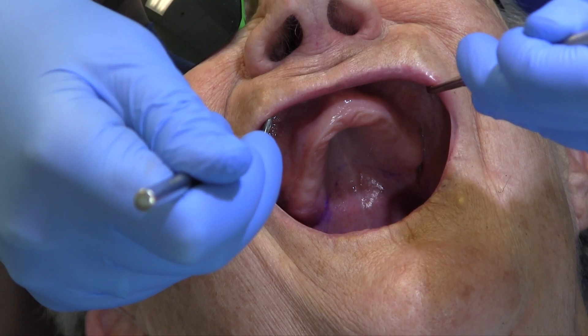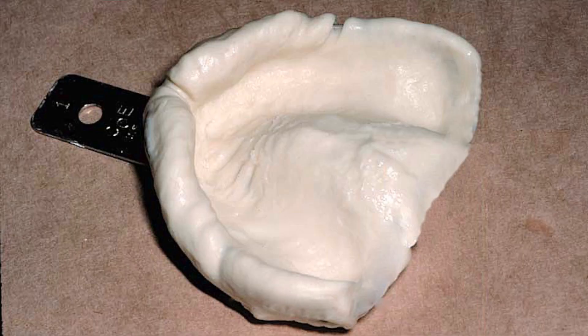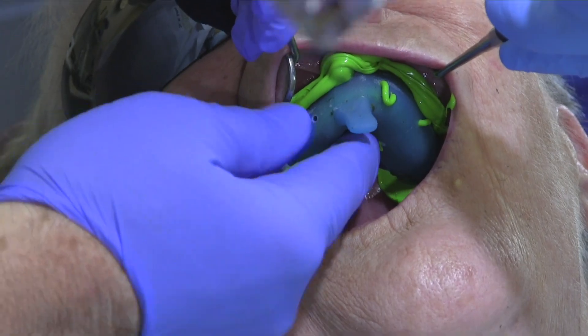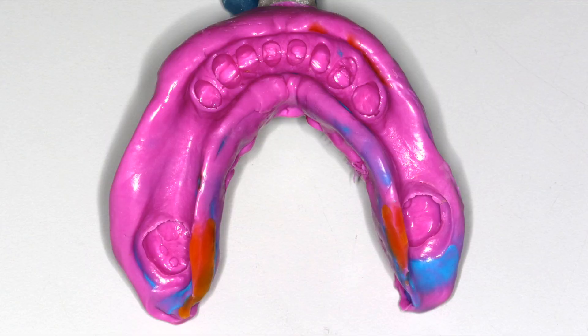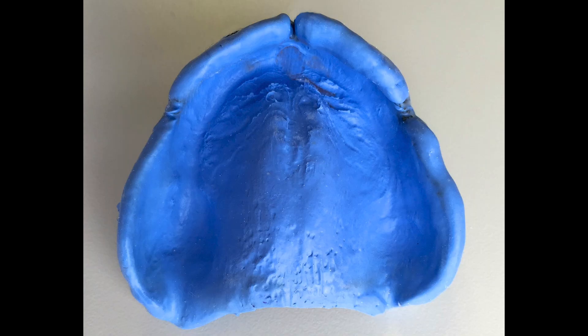The two-mirror impression technique for complete dentures. The two-mirror impression technique can be used for any impression, but it is particularly helpful when one needs to capture the vestibular fold, such as for complete or removable partial dentures. The goal is improved visibility with full capture of the vestibule, with a minimum of voids.